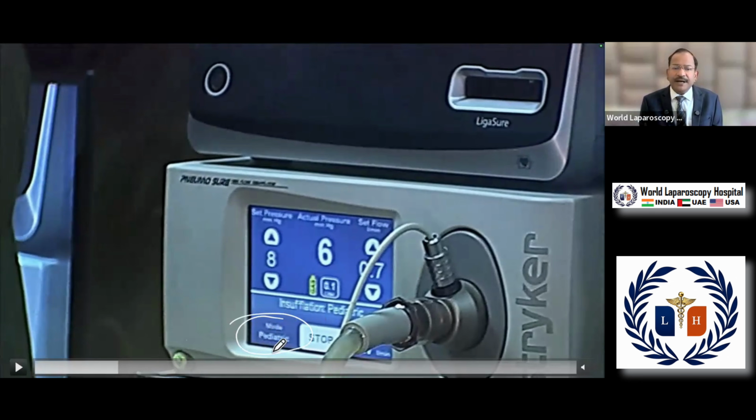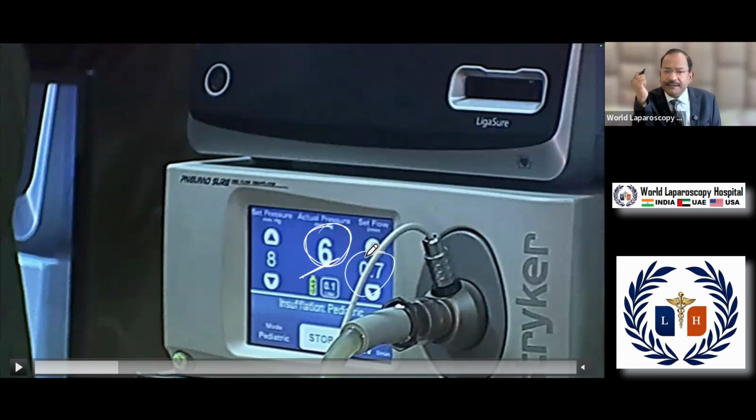See which mode it is? Pediatric mode. You can see this is pediatric mode. It is written here. Your preset pressure is 8. Remember, in pediatric, preset pressure is not 15, it is 8, and actual pressure is 6. And flow rate in pediatric, I told you the first day, should be how much? 0.1 liter per minute per year of age. So this is a 7-year-old child, so the flow rate is 0.7. If this child were 1 year old, the flow rate should be 0.1, and you can see this is pediatric mode.